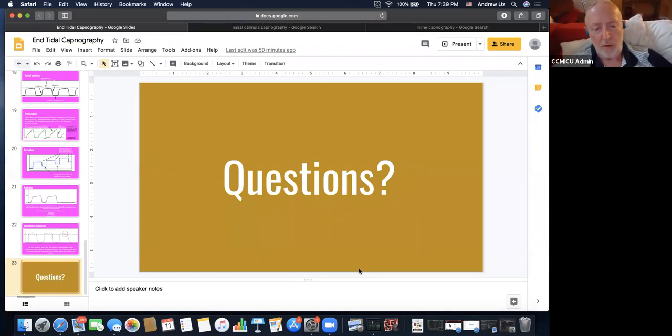There's nothing that stops a BLS provider putting on an end-tidal CO2 cannula. The only thing we would question is what you are going to do with it once you've got it on there. But I believe that otherwise it's a BLS skill.